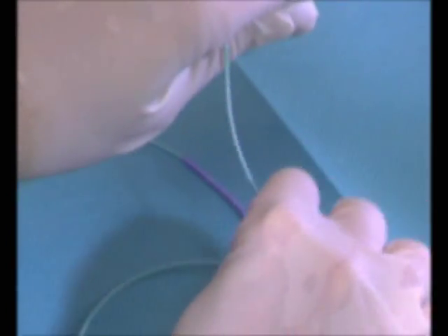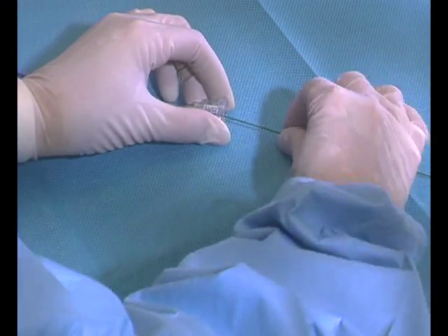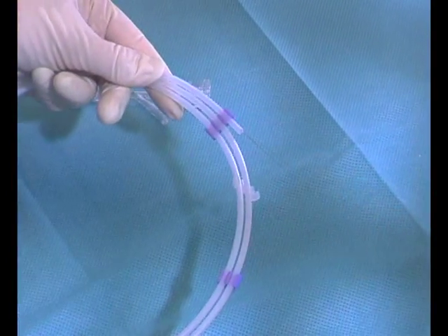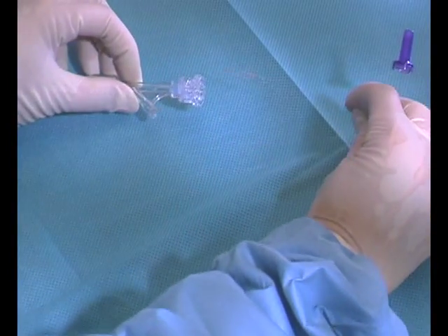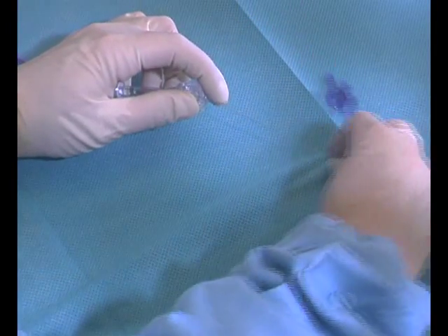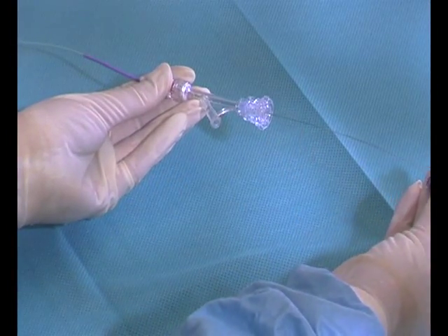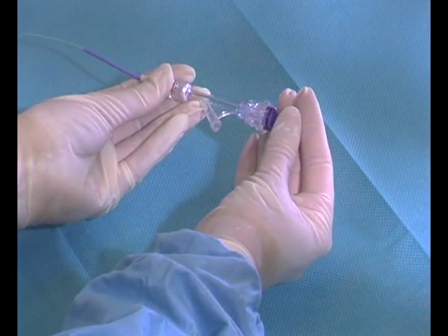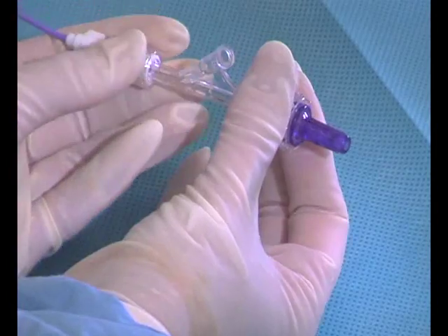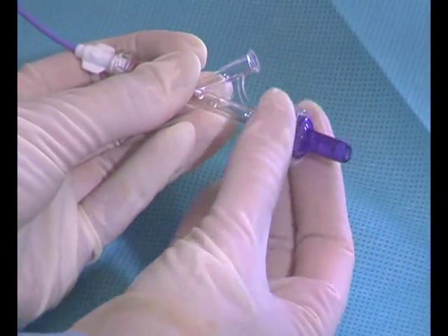The diagnostic guide wire is carefully withdrawn from the patient through the hemostasis valve. The Fountain occluding wire is then placed through the hemostasis valve and fed into the Fountain catheter. Care should be taken while advancing the occluding wire through the catheter. With the 4 French Fountain system, when the occluding wire has been inserted the full length of the catheter, snap the purple cap of the occluding wire into the back end of the hemostasis valve and tighten down the valve by rotating the fitting clockwise until the valve is completely closed.